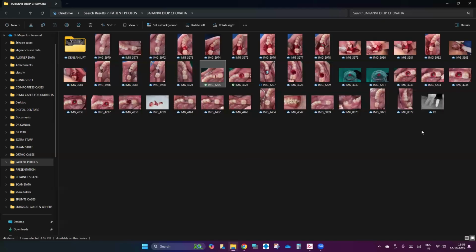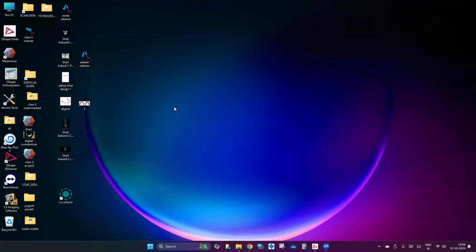No, this was a bone expansion. What I wanted to show you was a case where I drilled through the tooth. Is it not that case? Maybe. It doesn't look like it, it should be someone else. No, not this one. I can't recollect who that patient was.